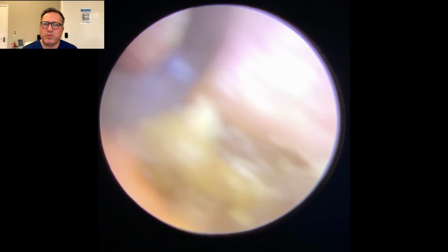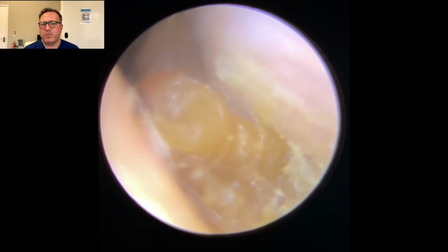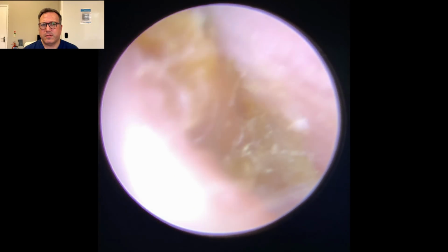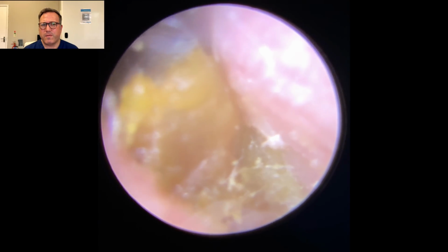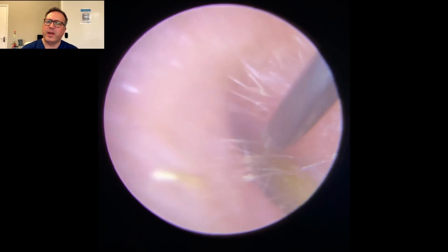So we're going to use the Jobson horn here. We're just going to go over the top of this front section of wax. Pull this down, just slowly working this out. It's coming away. I'm trying to put a steady pressure on it because you want to try and lift the whole thing if you can.